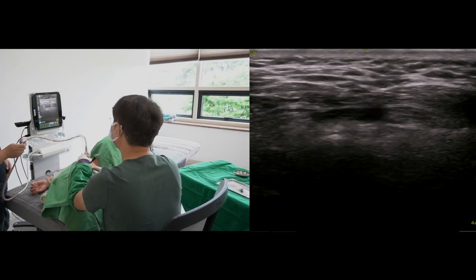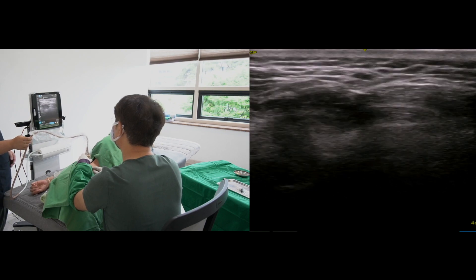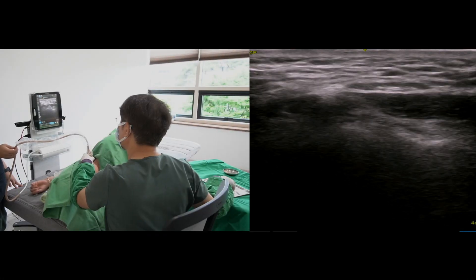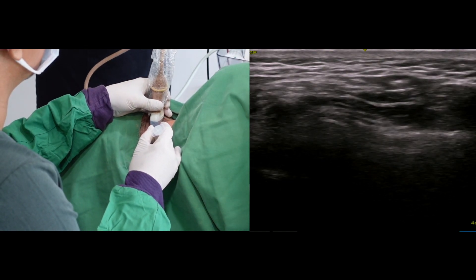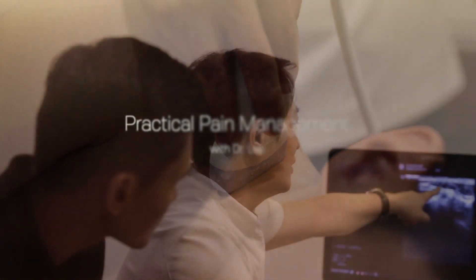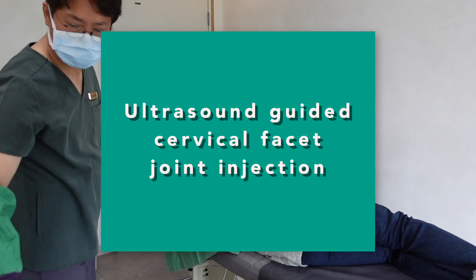There are two difficulties when I do facet joint injection by an in-plane technique. The first one is finding the exact levels. If you are a beginner, you may put the needle at the same level for two intended shots, so spend enough time to scan until you assure where you are going. Today, I will share clinical practice of ultrasound-guided cervical facet joint injection and think about the weak points of the in-plane technique.